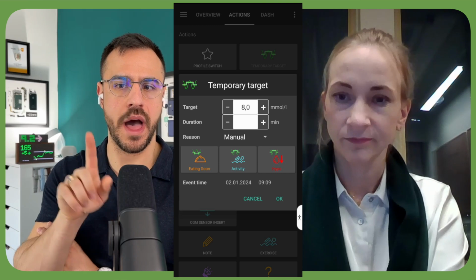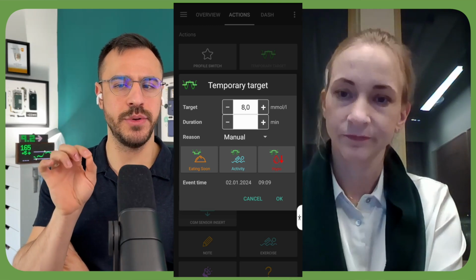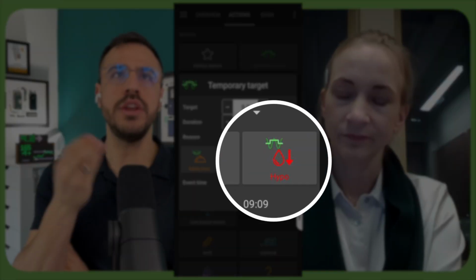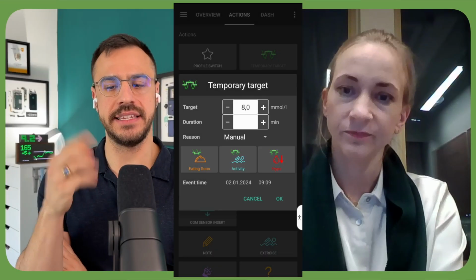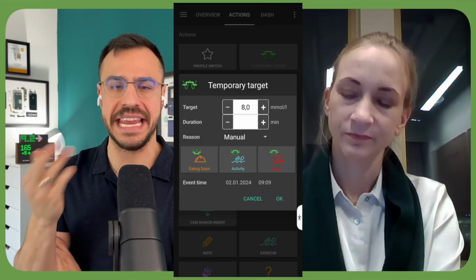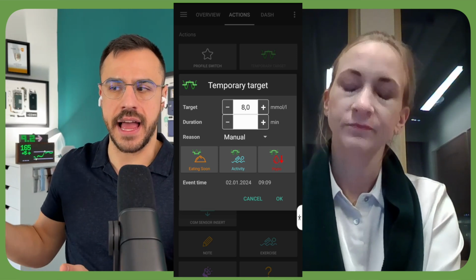How does that work? By the way, I've put a screenshot up that you had sent me on the screen for everyone to see while you're talking about this, so feel free to refer to it. That hypo setting, I see a button for it. What do you mean when you know you're going to have a hypo, but the app doesn't? Does that mean when you have an inaccurate Dexcom reading, you test your blood sugar, and it says I'm 140, I'm going to use US measurements, 140, but I'm actually 69, which is low? Is that what that's for?